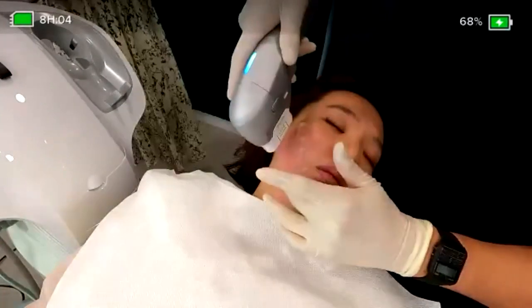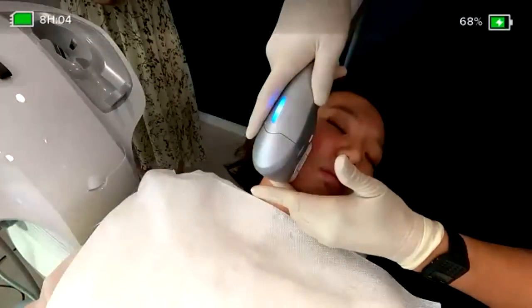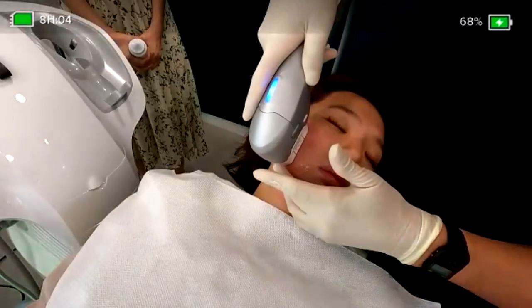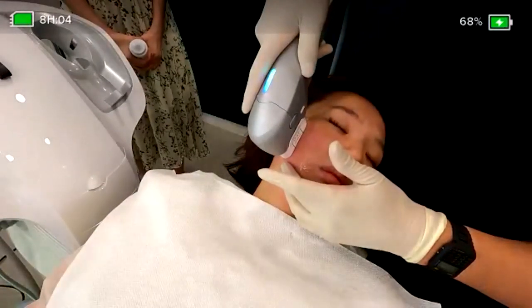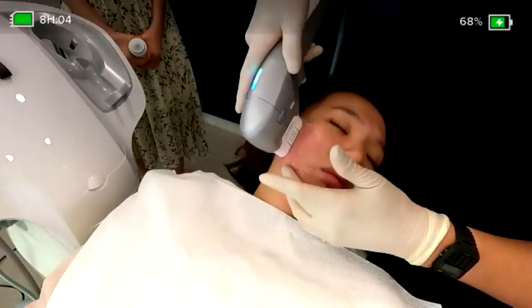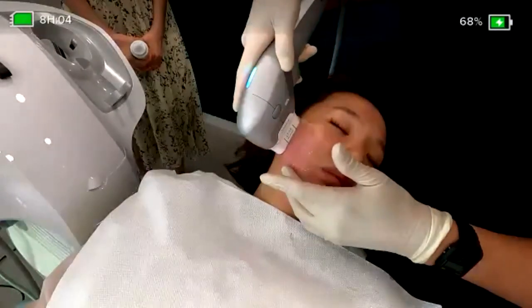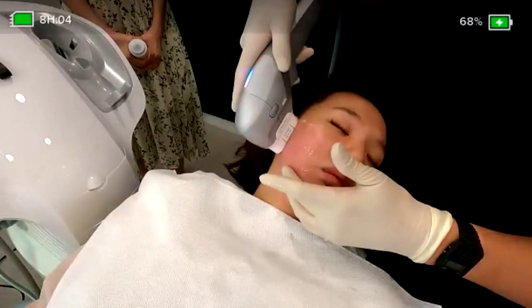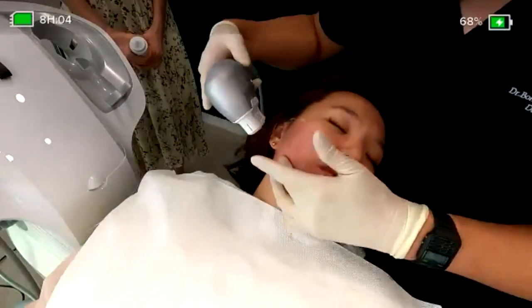Usually, if you are making the DAO lines here, the margin of the DAO line is quite a good way to do that. And if you want to make an overlap, please check after one pass if any damage is seen immediately from the overlap pass. But usually okay.